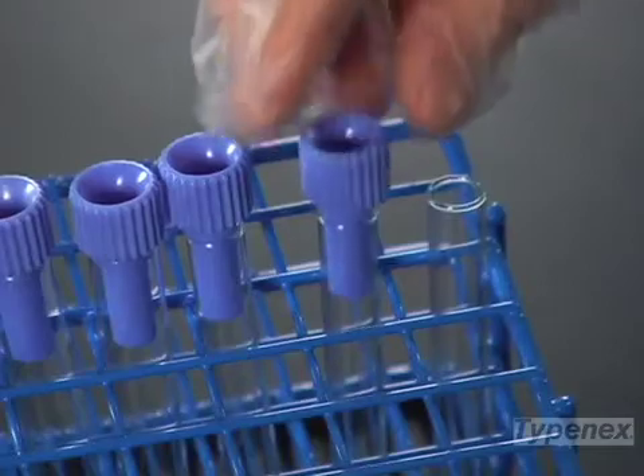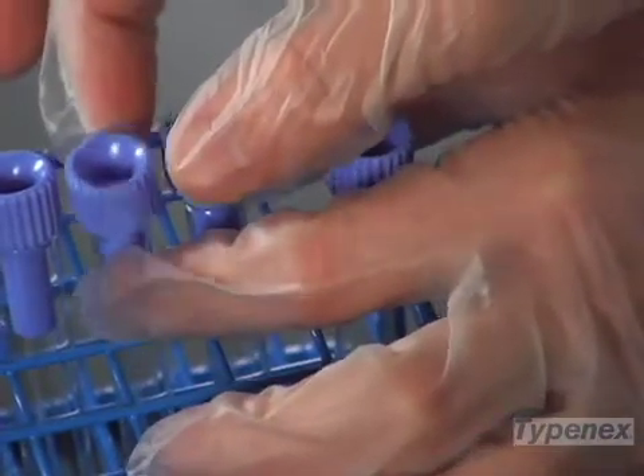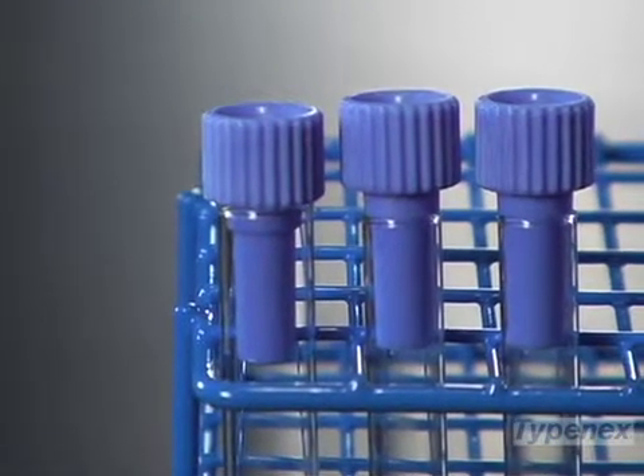Let's get started. Insert the narrow end of the Typesafe segment sampling device into the test tube. Ensure the tube is properly aligned with the holder by placing Typesafe directly on top of the test tube with the narrow end facing straight down, reducing any angles or gaps.